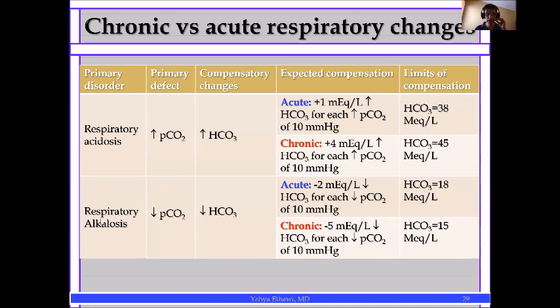Now, if you have respiratory alkalosis, which means you are hyperventilating, which means you are washing out CO2, your CO2 goes down and your pH goes up. So what bicarb will do is lose bicarb. Either you lose it by the kidney or you combine it with water and send it out through breathing. Again, respiratory alkalosis, washing CO2, dropping CO2, high pH, the body starts to lose bicarb to bring the pH from high back down.